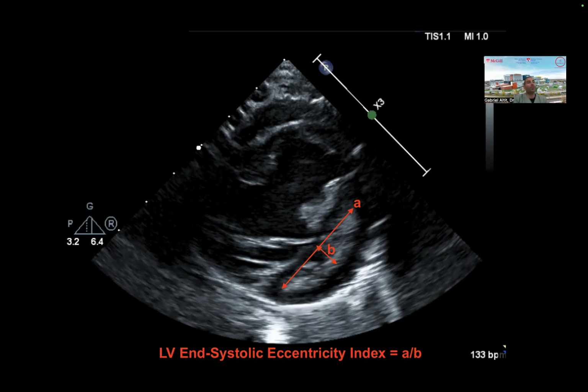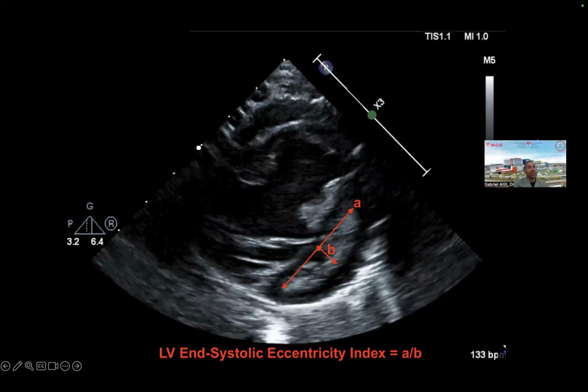It doesn't, not for Philips. But it tells you the range of where you're at, and the machine adapts this range as you're scanning. So you select it on the machine.